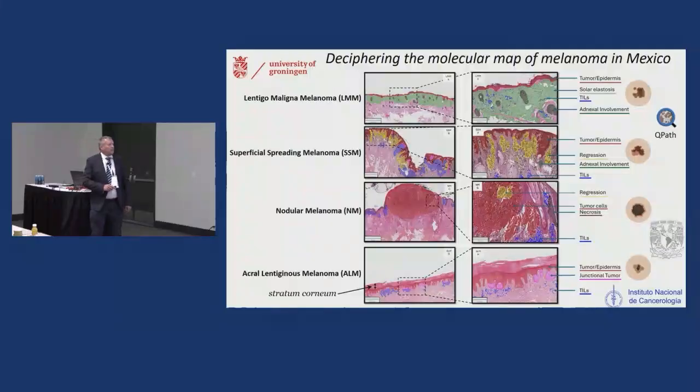Digital pathology and assessment of the tumor by the pathologist is very important. Here you see the annotation that this type of workflow allows. It also allowed us to assess which type of profile we get for proteomics, and to include that in the statistical analysis.